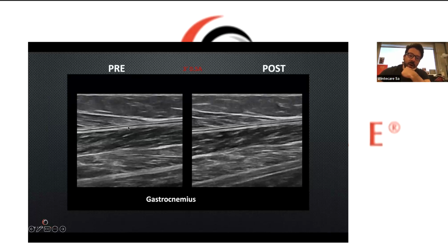Inside, we see a grayish aspect. What does this mean? It is not so fluid, okay? So it could be sticky or jelly. So the movement will cost more effort. After the application of 3 minutes, 0.5 ampere capacitive hyperthermic with no mechanical action, we can see that the dark and white contrast is much clearer, okay?